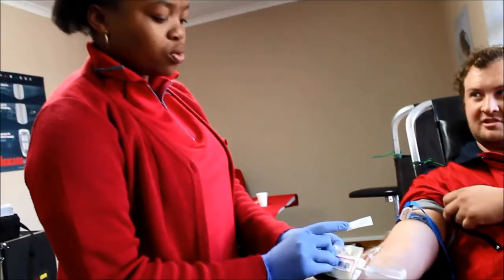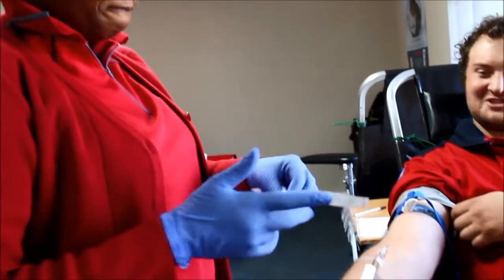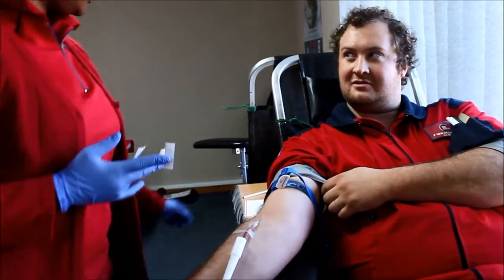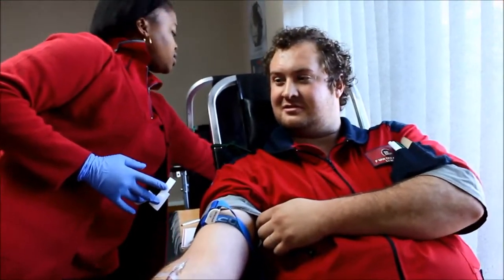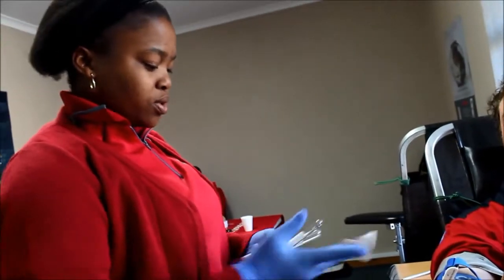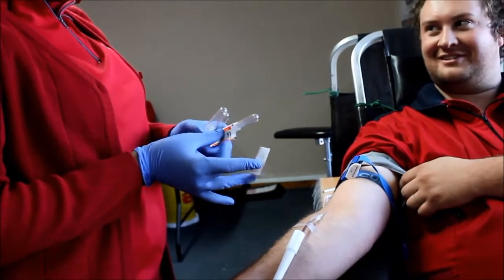Do you separate the plasma from the platelets from the bags? We separate it. When we separate it, you get plasma, red cells, and platelets. That's the three bags that collect the platelets, red blood cells, and plasma. The white blood cells are not used — they die.